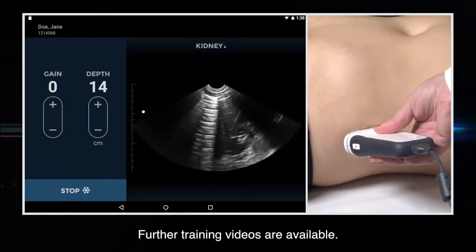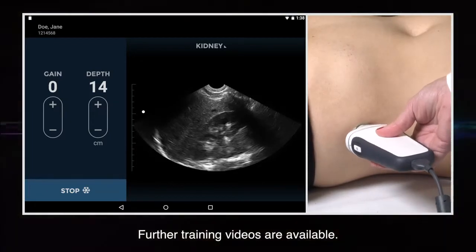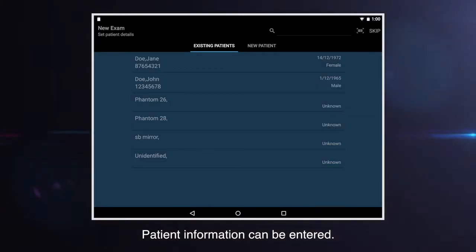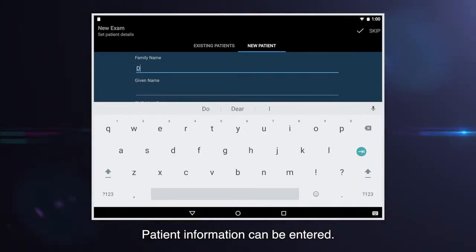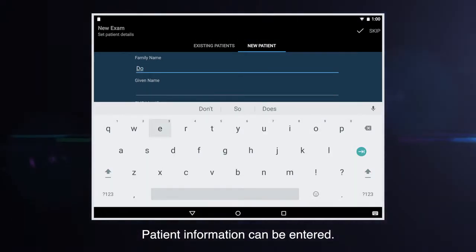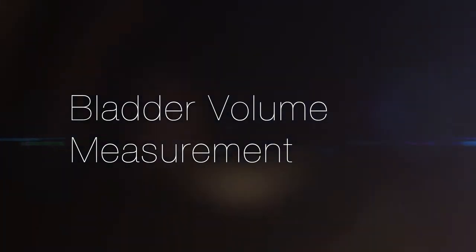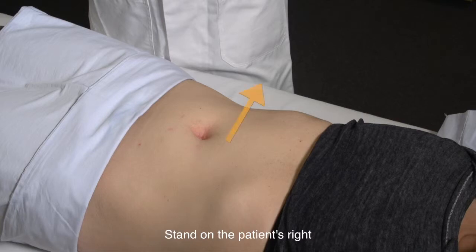Please refer to other Cygnostics training videos for the ultrasound application of the uScan. Patient information can be entered either before or after the scan. To measure bladder volume, ensure the patient is in a supine position and stand on the patient's right.